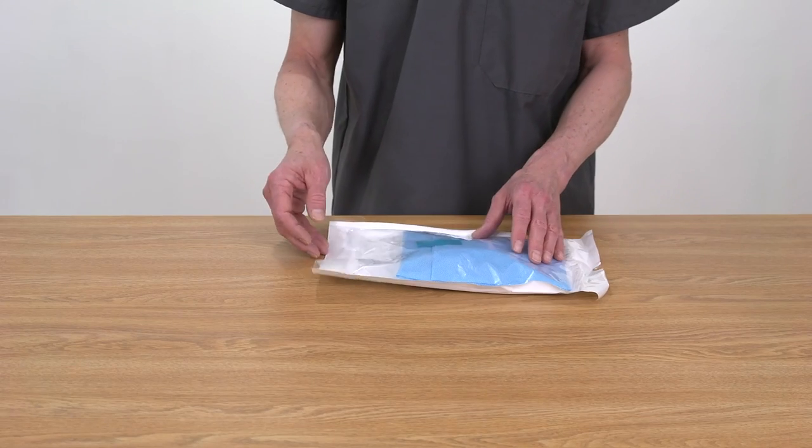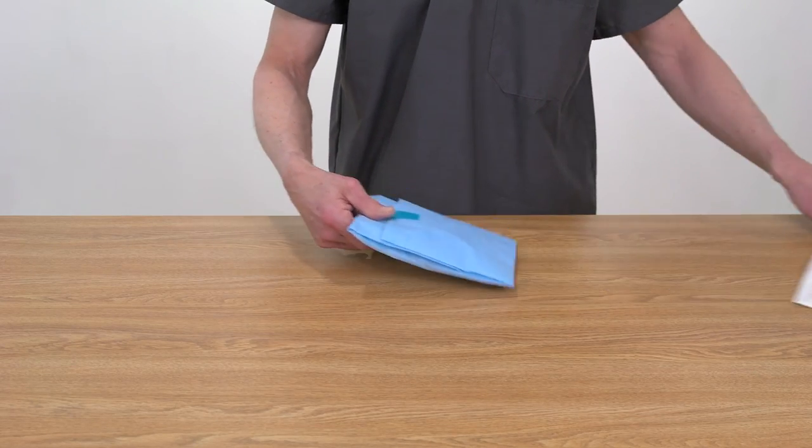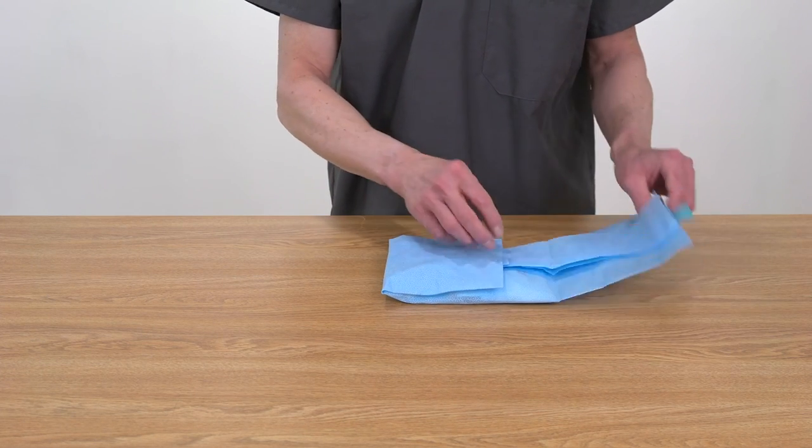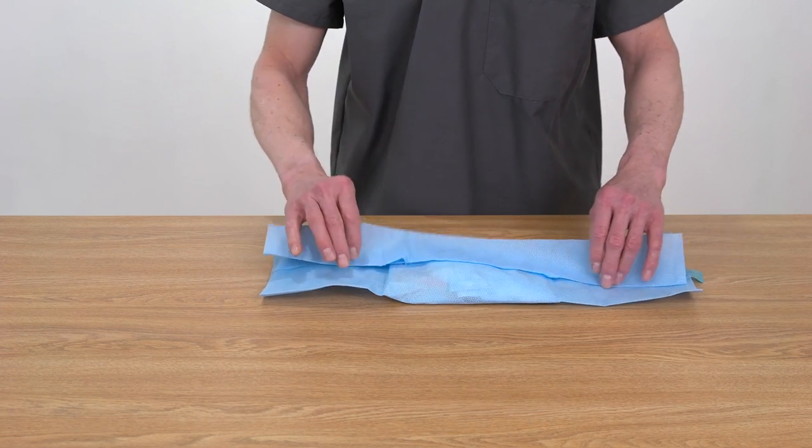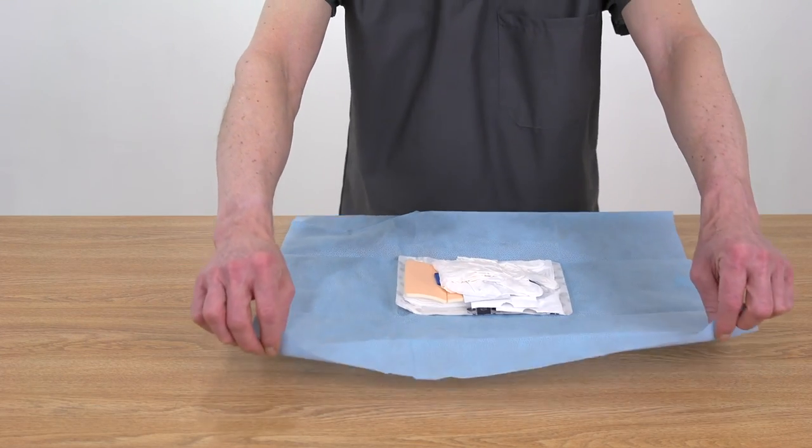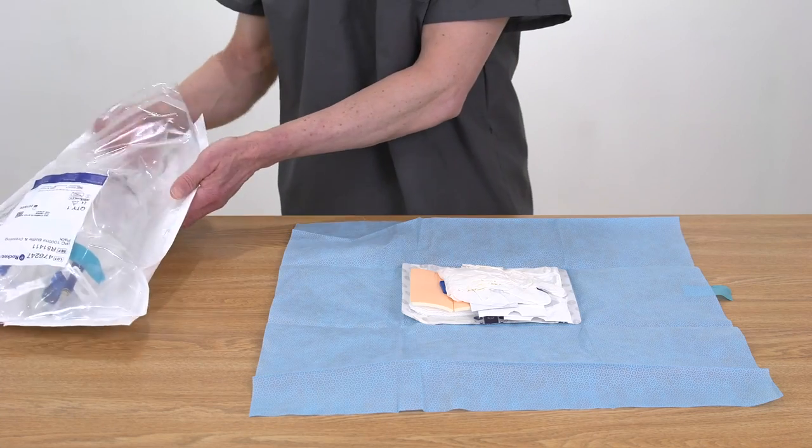Open the procedure pack by peeling the pouch apart. Inside, you will find a blue sterile field. Position this with the tape facing up. Carefully remove the tape and unfold the sterile field, using only the edges or corners. Make sure the contents remain in the center.